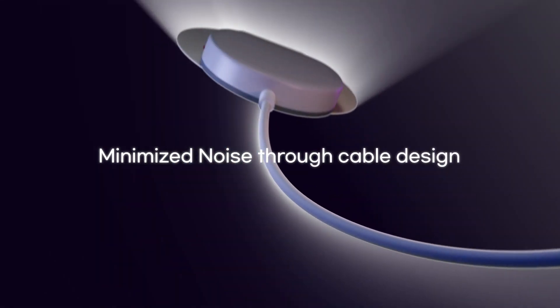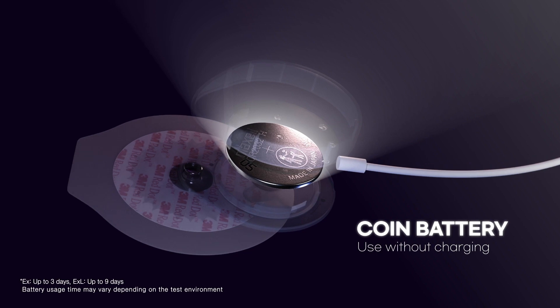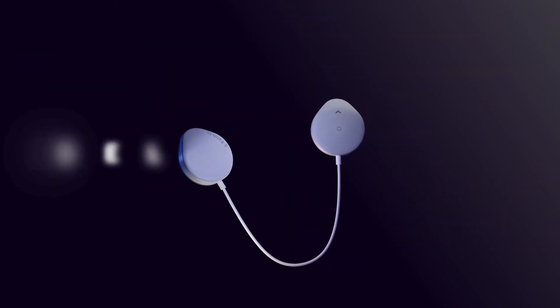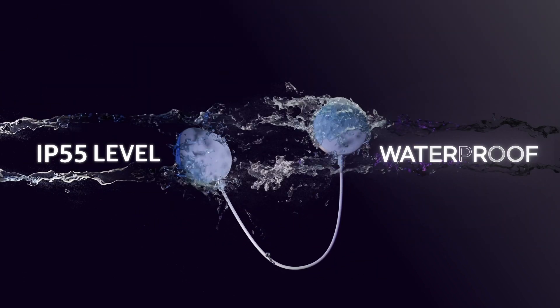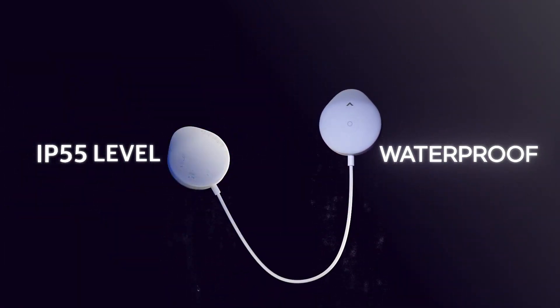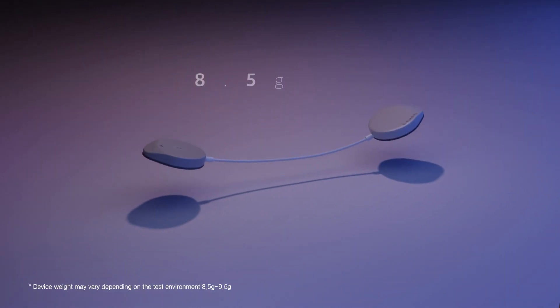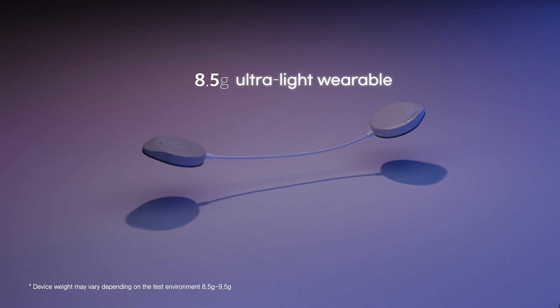Aspatch minimizes noise during activity, allows for extended periods of testing without charging, and offers outstanding water-resistant capability. Aspatch provides an innovative lightweight and comfortable design.